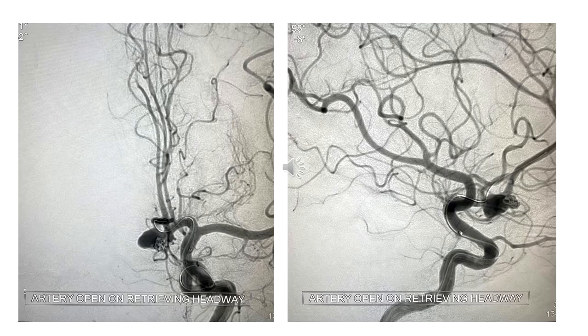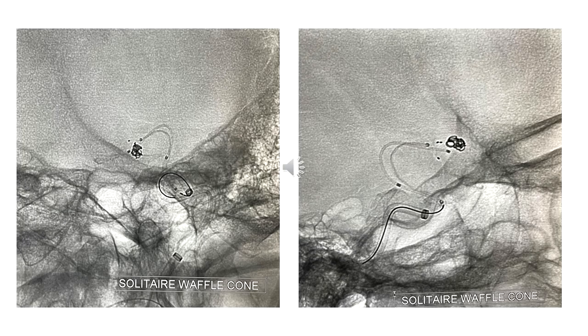And lo and behold, on removing the Headway, the occlusion and the straightening, everything disappears, which was happening with the 17 system as well. And we can see there is no thrombus, nothing, but probably because of the sharp bend here and the double curve, triple curve rather, this artery was not sustaining navigation of the different microcatheters and wire system. I have to forego the thought of stenting that ACA, and I thought of now using this waffle cone technique.